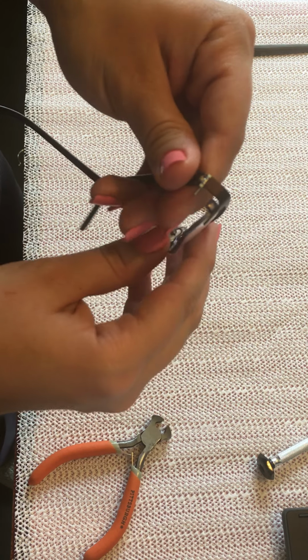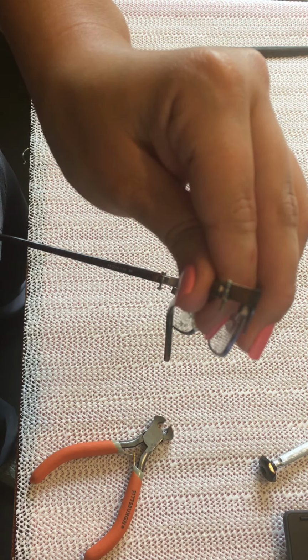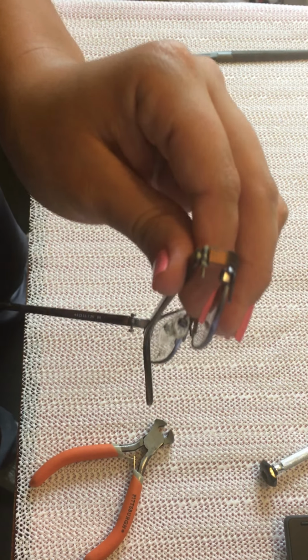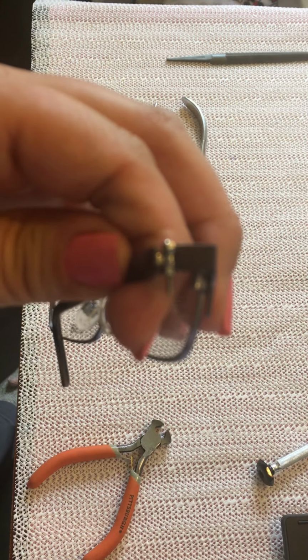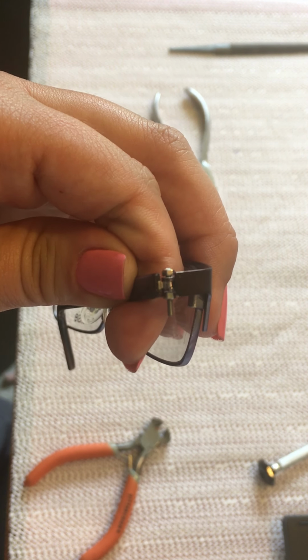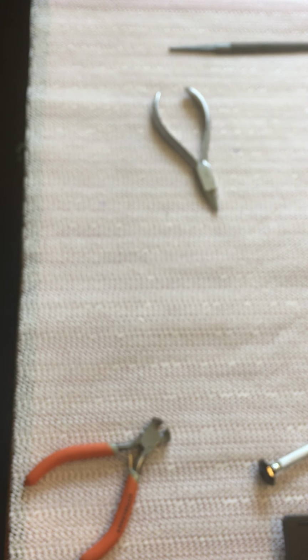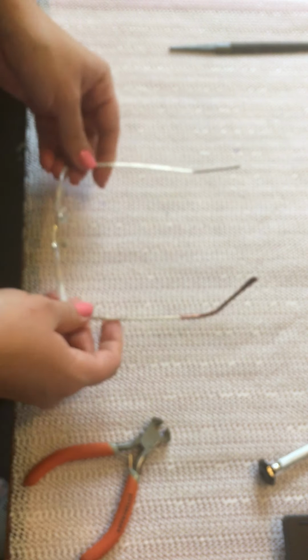But the nut and bolt should end up looking something like that. It should end up looking something like that. Okay, that was the nut and bolt replacement. The next replacement we are going to do is we're going to replace the temple tips.